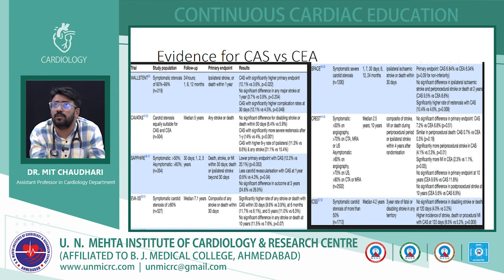Such patients are usually excluded from these trials. So there are no randomized controlled trials in patients undergoing coronary artery bypass comparing carotid artery stenting versus CEA, and the majority of the non-randomized data shows that carotid artery stenting might be better in such patients.